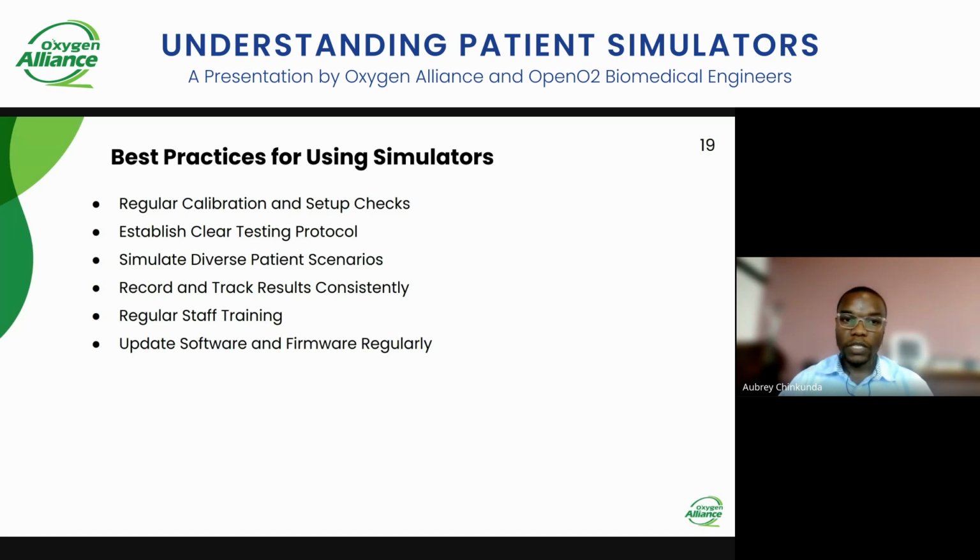When you are doing the testing, make sure you simulate diverse patient scenarios. Don't just set the SpO2 to 90 and the heart rate to 65, and then you're done. You need to simulate various scenarios to make sure that the test is efficient, because one scenario might work and one scenario might not work. So you need to make sure that you test the various set of scenarios on the simulator.